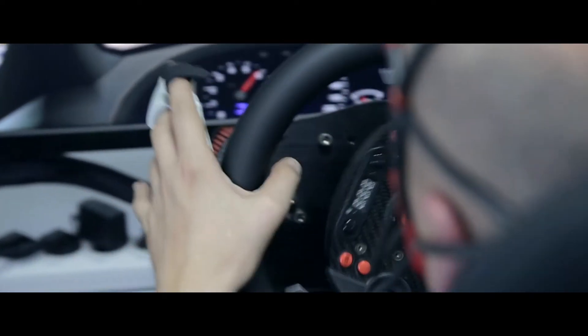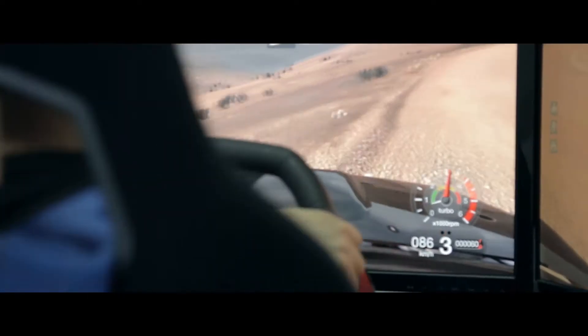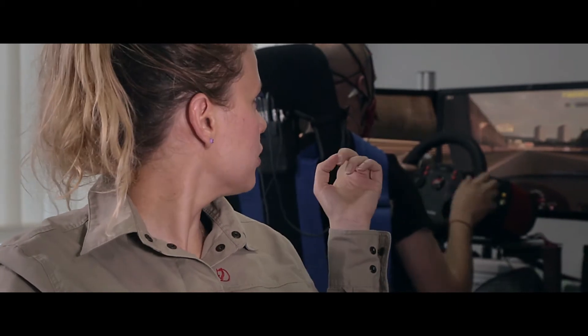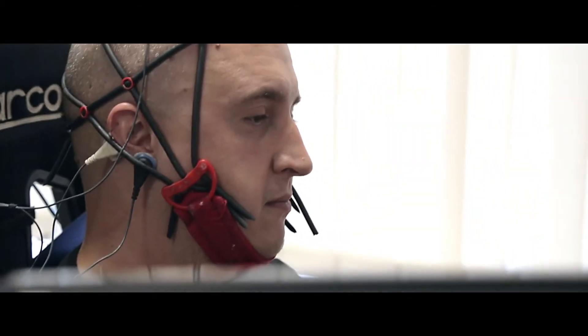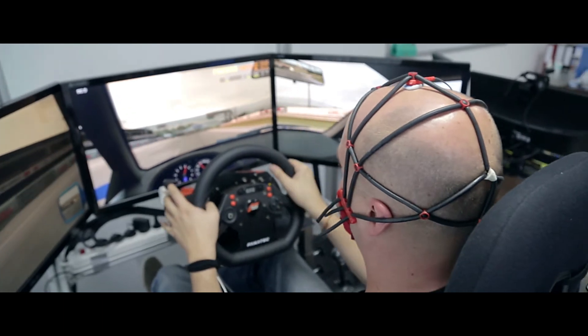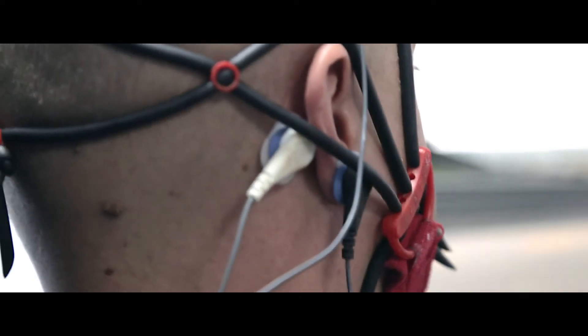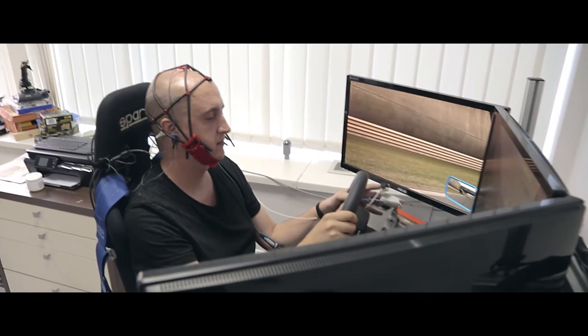We attach a galvanic skin response sensor to other fingers, and we also attach a temperature sensor that measures relaxation of the muscles. We also attach a sensor for breathing around the waist, and as you can see, our driver has a cap on his head with EEG sensors underneath that measure brain activity.